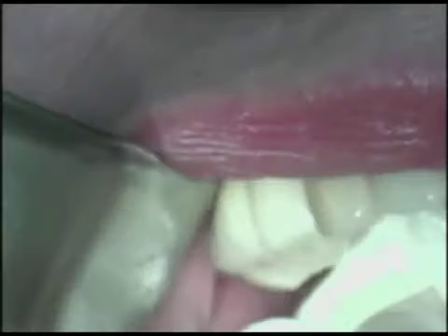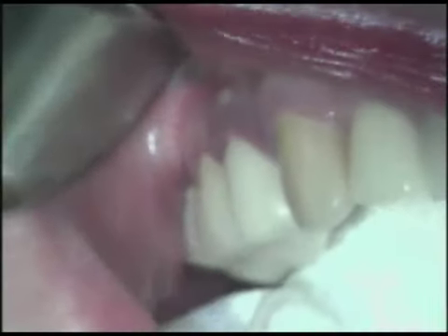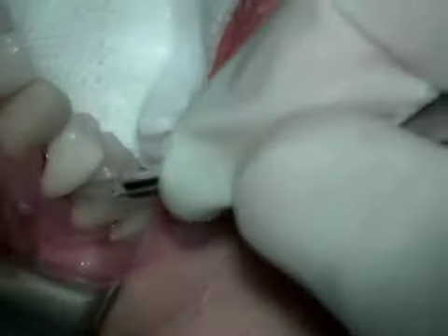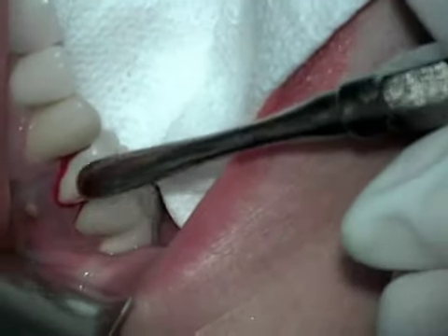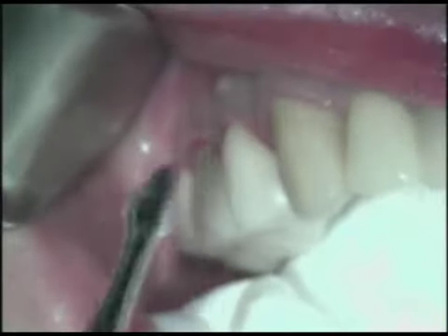Okay, so now let's get to the surgery. So we're going to put a throat pack to pack off the posterior pharynx behind the tooth. We're making a sulcular incision, and you notice there on the facial aspect there is a small fistula from the infection that's been around this tooth. This has been symptomatic for probably a couple of weeks.